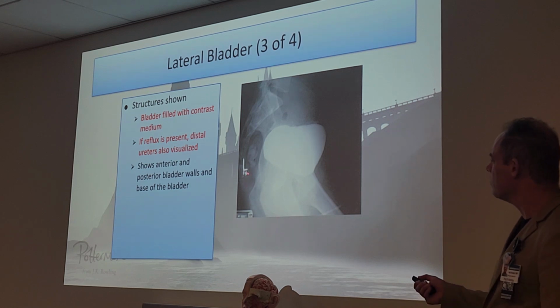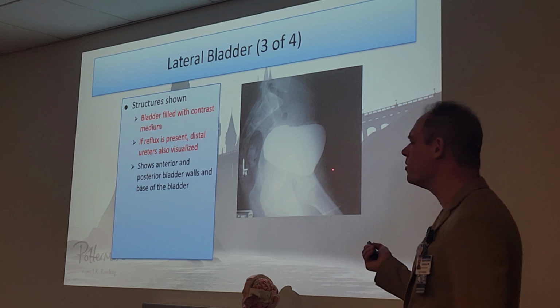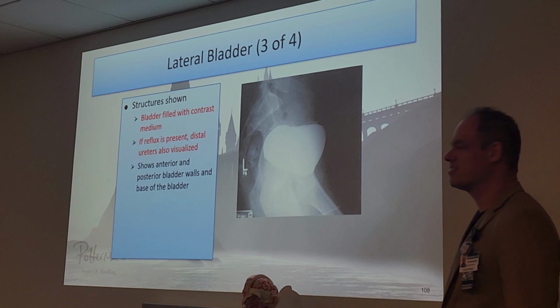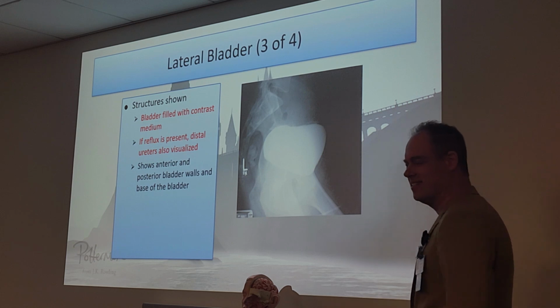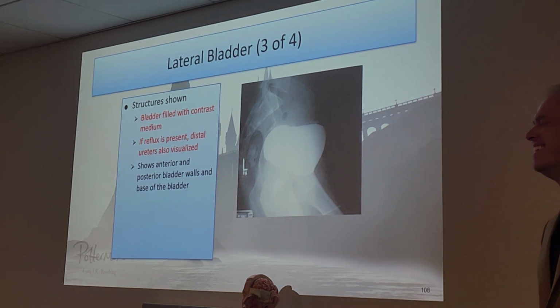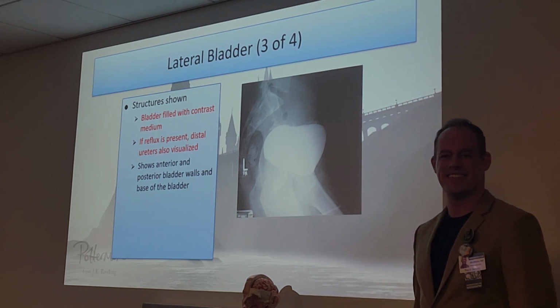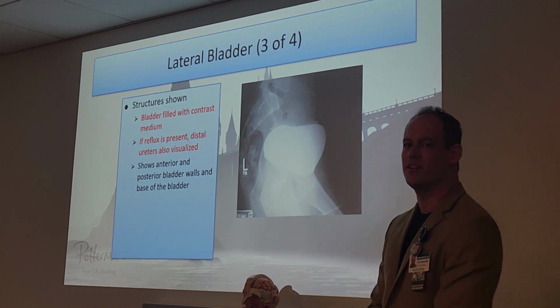It looks like they put their marker in the rectum there. I would put it in the front personally. Actually, you might not want to put it in the front because it might get peed on. Decisions. Yeah, decisions. You want fecal matter or urine on your marker? That's the greatest choice in life. Soft tissue cookies. Barium enema in the front, bladder. Soft tissue cookies, I've heard that one. Hey, I would just throw it in the glove, you know? There you go. Put it in the glove. Work smarter, not harder.